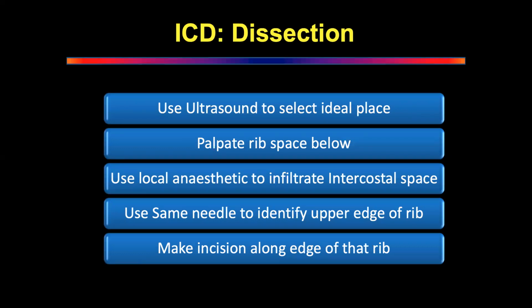Okay, what should happen? Where is your hand when you are about to enter the pleura? The two hands. Give me the location of your two hands. If you are a right-handed person, then the right hand should be holding the arterial forceps in a closed position, and the tip of the arterial forceps would be resting on the index finger of the non-dominant hand, and it should be supported on the border of the rib.